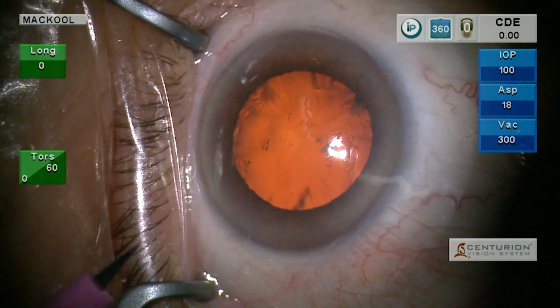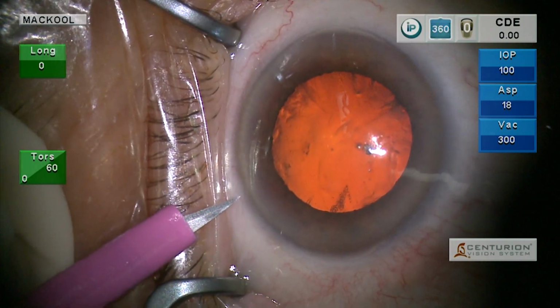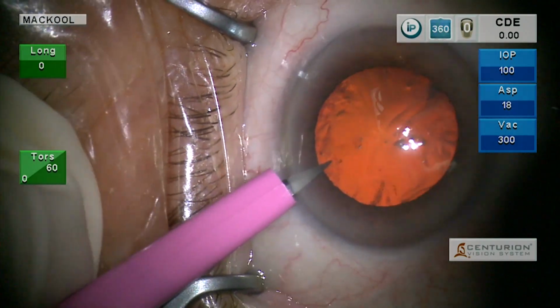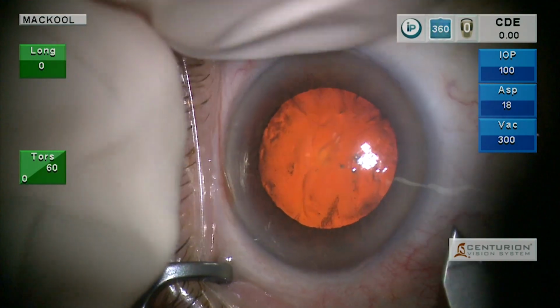So our plan here is a routine phaco and IOL insertion. The patient has a Bell's phenomenon and can't really overcome it. So we still can see the supratemporal limbus and make our side port incision. And then we can, this is a right eye.